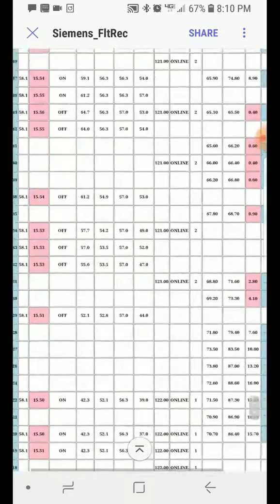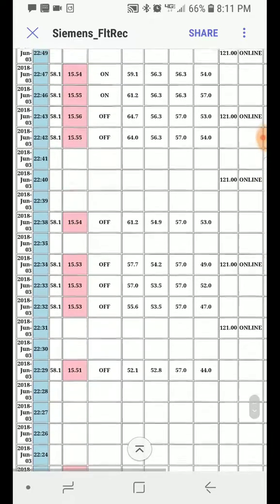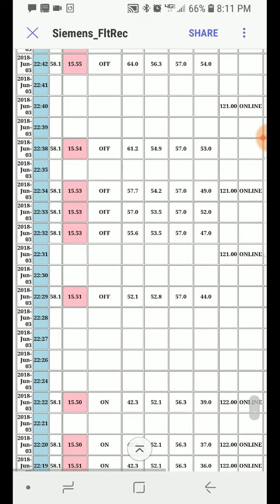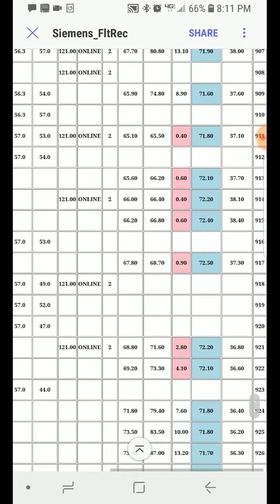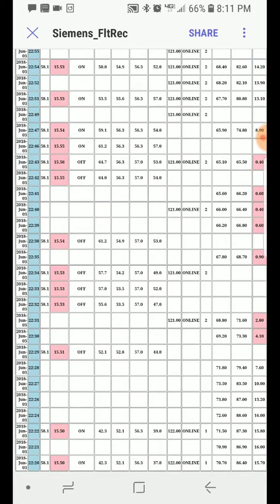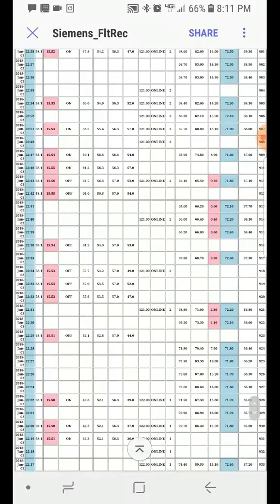So it looks like 480 took a hit here, a power surge, and the MSUP stopped communicating for a short amount of time, and the chiller continued to work. And you can see it started talking again pretty shortly, and then it read that the compressor was off until the compressor knew that it had flow, and then it turned the compressor back on. And you can see the differentials represented here. Same thing that we saw on the graph. So, that's it.